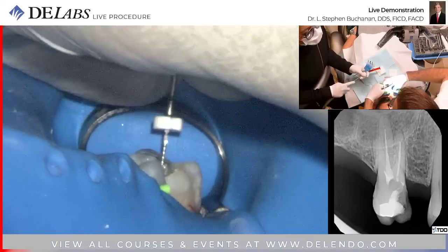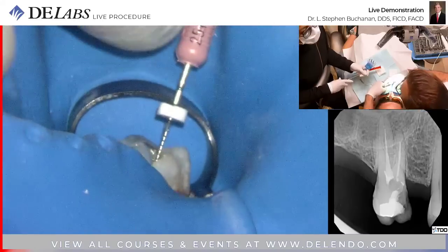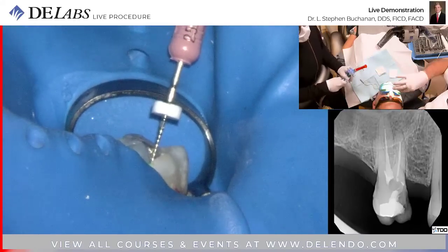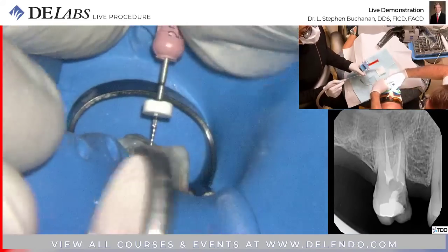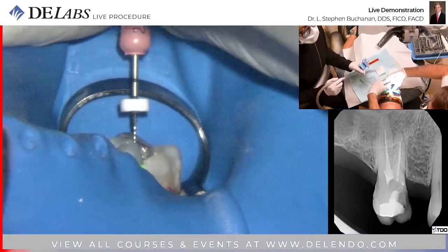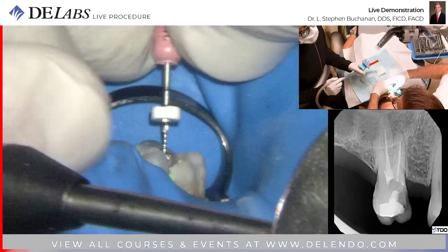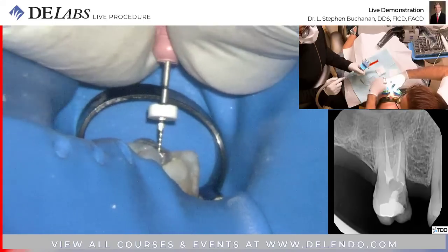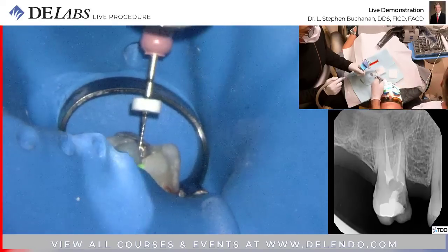Put blinders on. Okay, so notice I have a finger rest over here. If I just pull this thing out, I've got to rebend the tip, get back there, and try and get back in, a tricky thing. I might not ever get past that impediment just as I click past right there. It's a little bit random. So I get a finger rest. I'm going to do little push-pull motions. Let's get a little bit of lubricant in there.